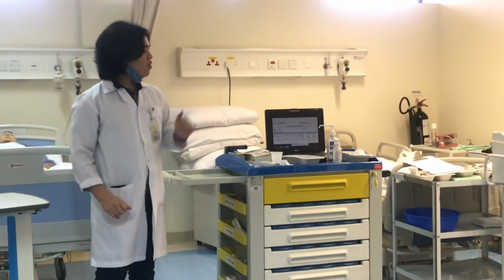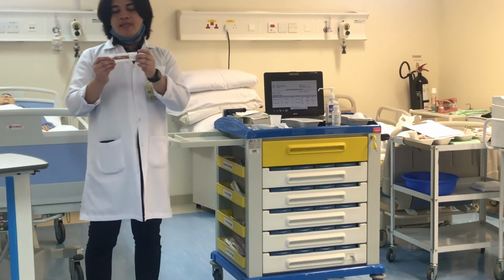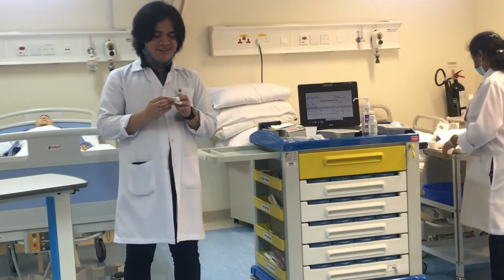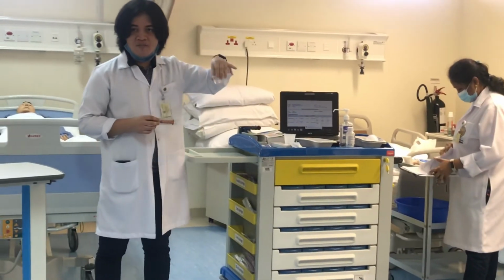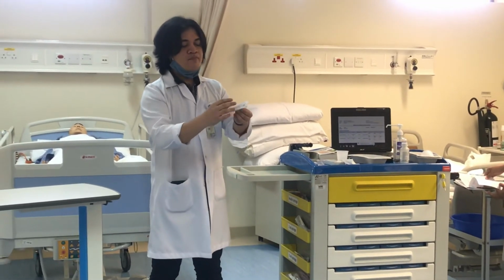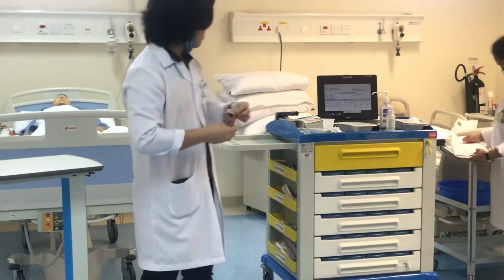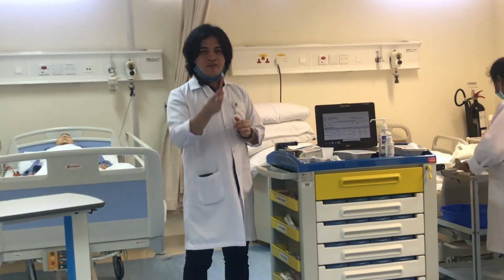However, if the order of the medication is less than 1 ml, you should use a medication syringe. Okay? Correct? 1 ml? 5 ml, sorry. If it's less than 5 ml, it's very small and it's very difficult to accurately measure the medication. But normally, especially in Pedia, they're using this dispensing syringe. It's the same as the syringe that we are using. But usually the dispensing syringe will be colorful. Yeah. Pink, violet, purple color. Okay, normally, if the order is less than 5 ml, we use this one.